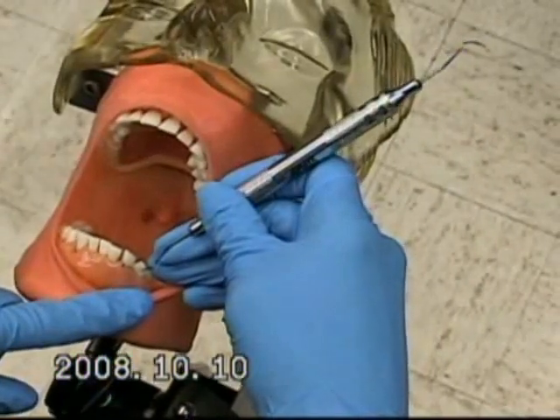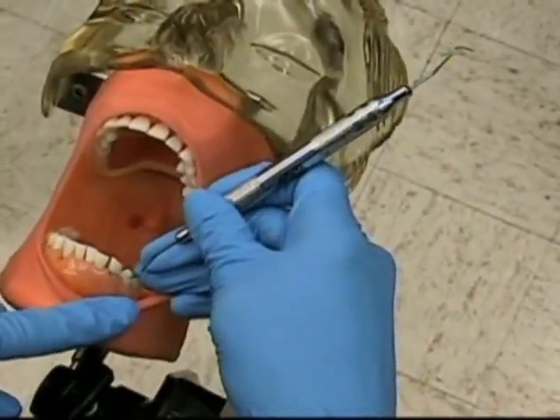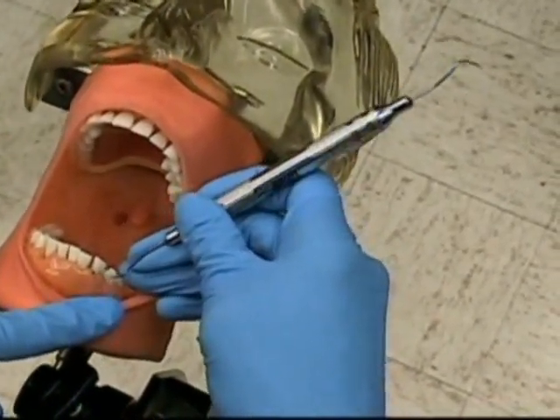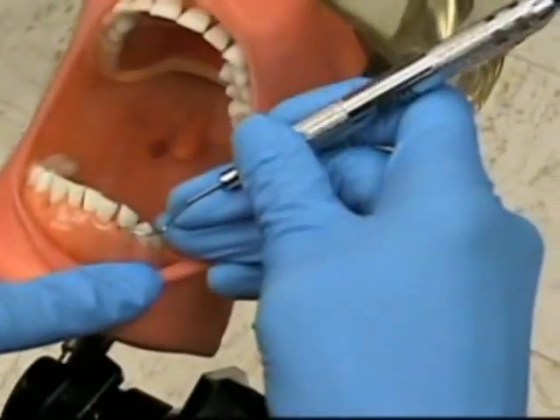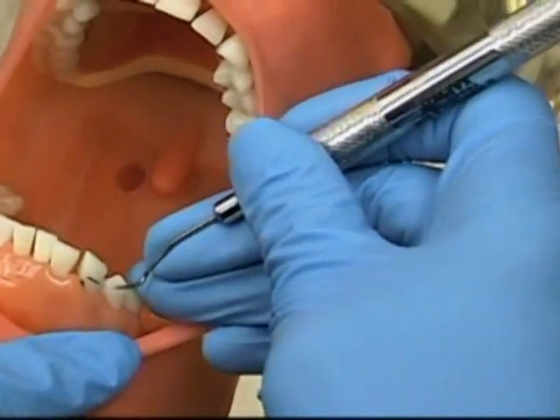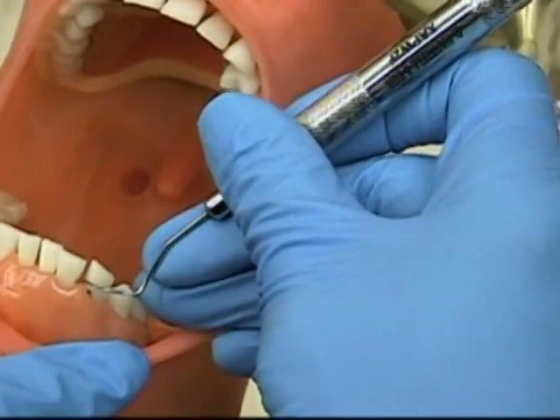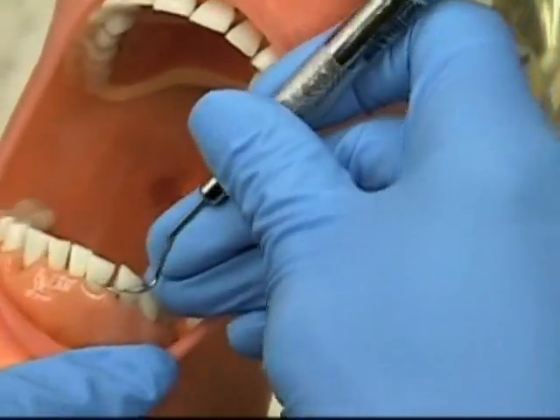Going to explore the anterior teeth, surfaces towards you. First thing is the wrist rock. Start at the midline of the tooth with the tip on the tooth, not the point. We'll stay supragingival so you can see, and roll interproximally.